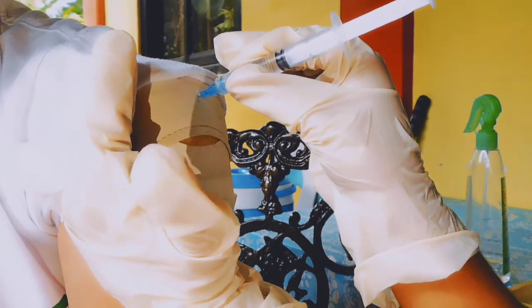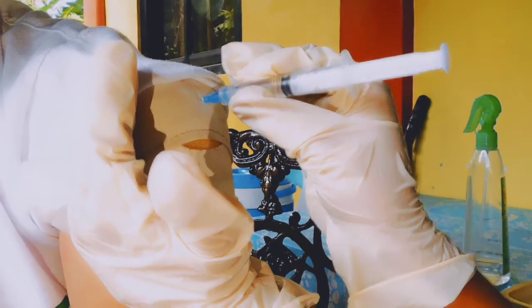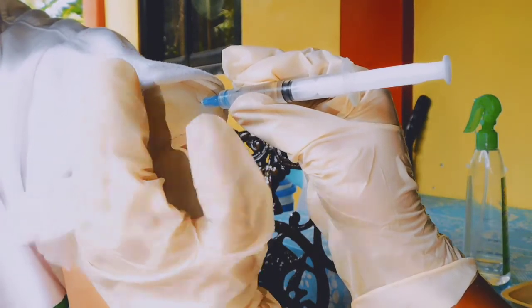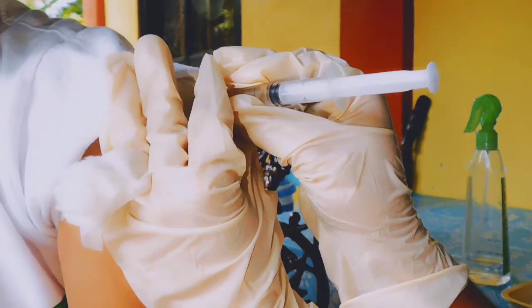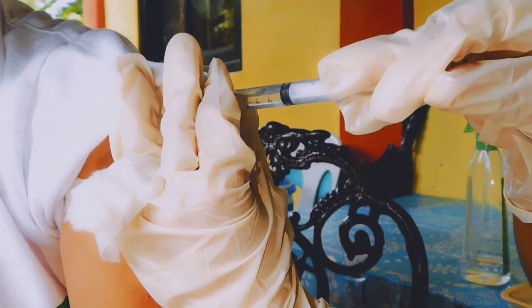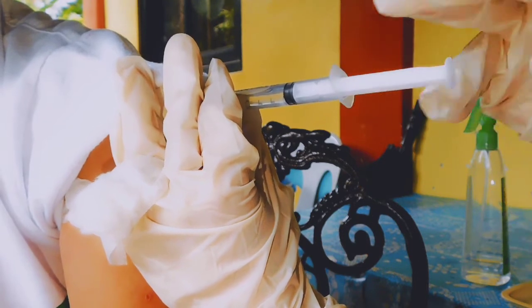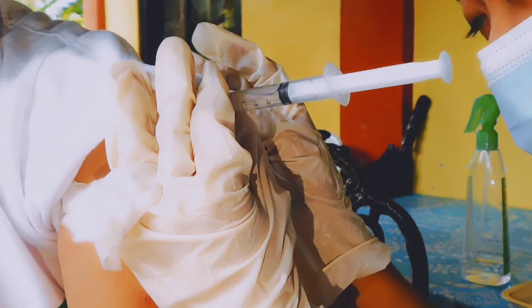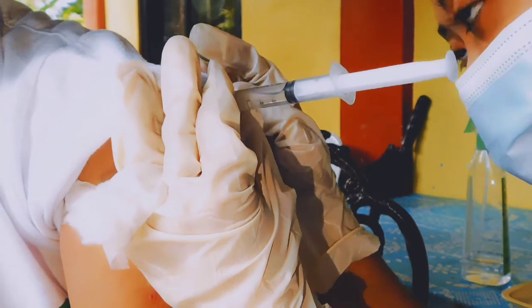Hold the barrel of the syringe steady with your non-dominant hand. Here, hold the barrel and then aspirate. If I don't notice any blood when I aspirate, then it is ready to inject.